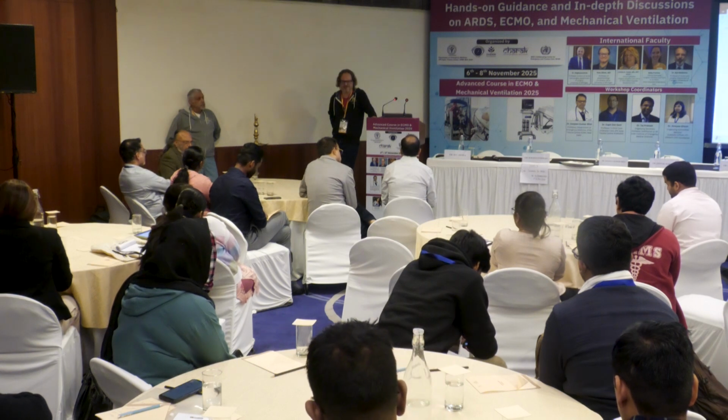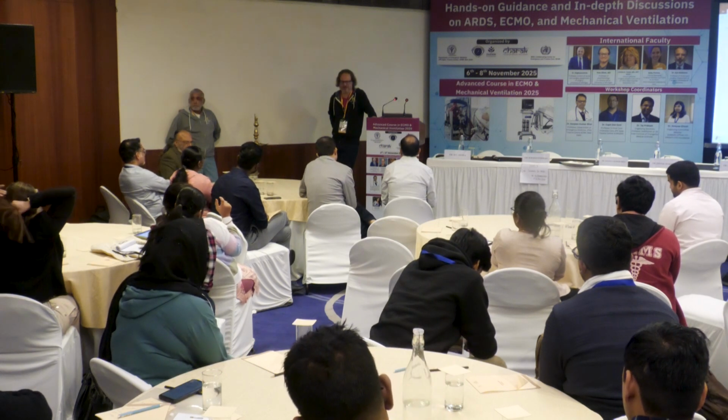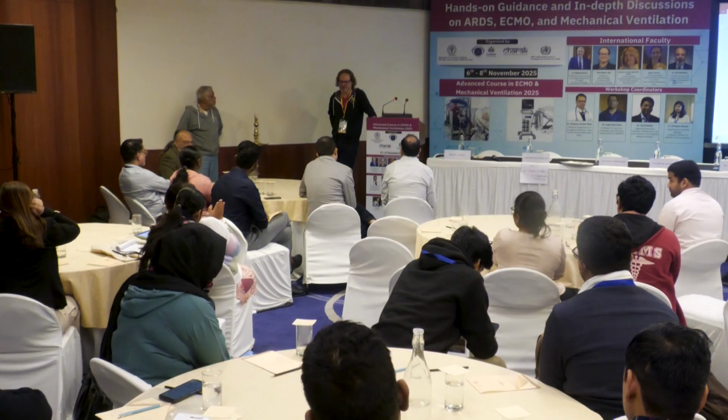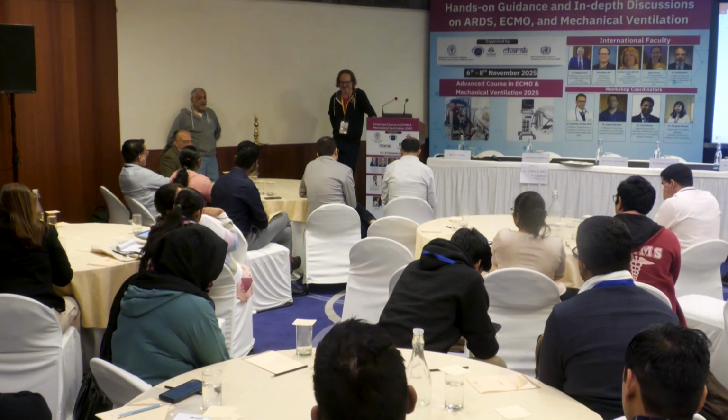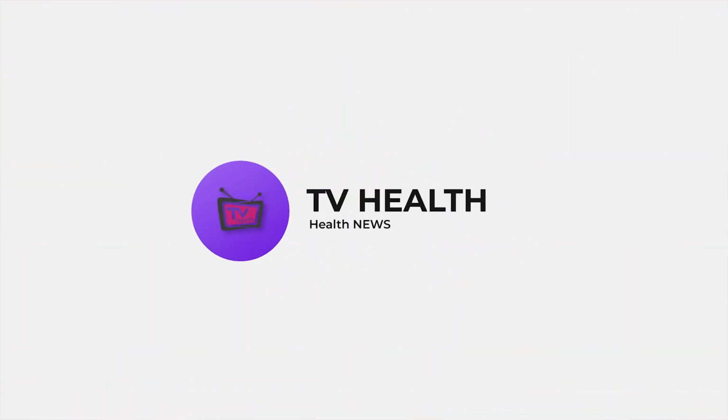And you do have to be careful when you have ECPR for cardiac arrest. Defining what's the artery and what's the vein is not as easy as you would think, because you don't have the pulsatility, you don't have the color changes, etc.